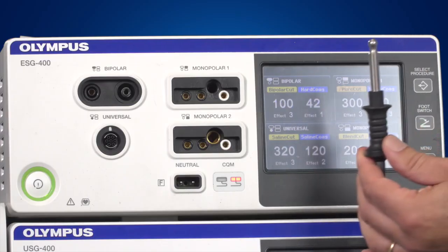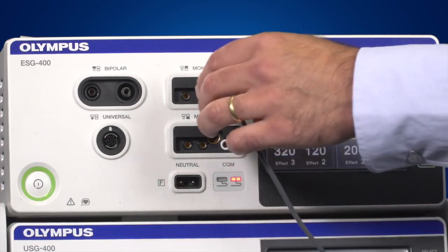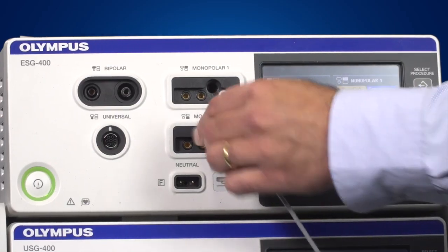The eight millimetre Bovi plug gets connected to the central socket in the monopolar one connection area. The monopolar Urbi type plug gets connected to the central socket in the monopolar two connection area.